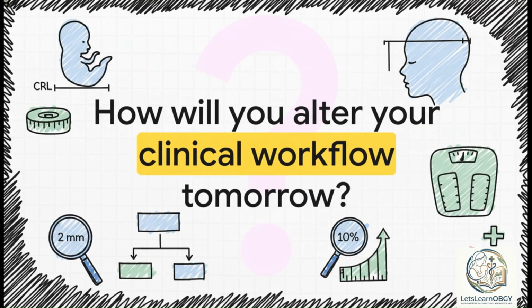Well, we have covered a tremendous amount of ground today, from those very first early embryonic dates all the way up to third trimester weight extremes. But I want to leave you with a thought as you head back to the clinics. Knowing that a mere 2 mm error in your first trimester crown-rump length can shift your patient's growth percentiles by up to 10% months later, how will you alter your cursor placement and your overall clinical workflow tomorrow? Remember, precision isn't just about taking good images, it's literally the very foundation of safe, evidence-based obstetric care.